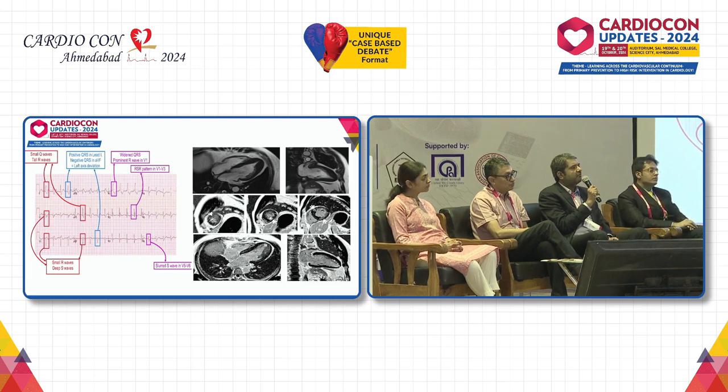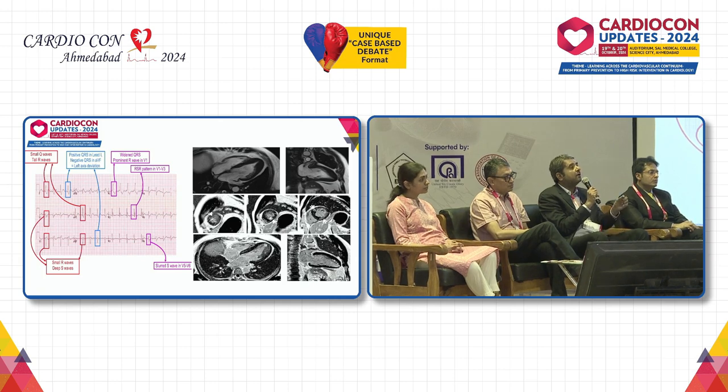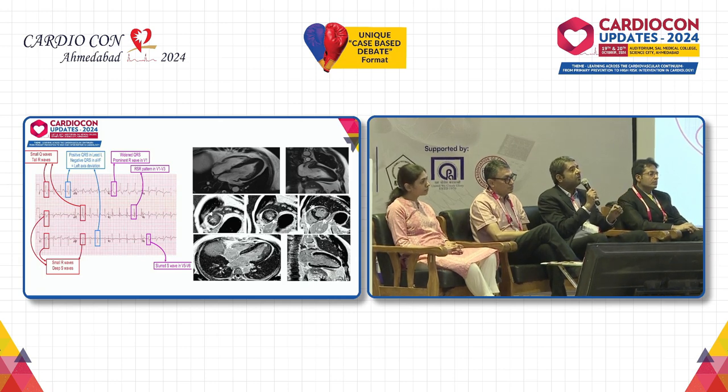And the purpose of maybe putting a left bundle pacing lead, even if you just try to project it as distal as possible, probably empirically trying to avoid the scar location and putting it distal to the scar, but still, if at all, the scar is an extension distal to the pacing lead position. How do we encounter that problem?